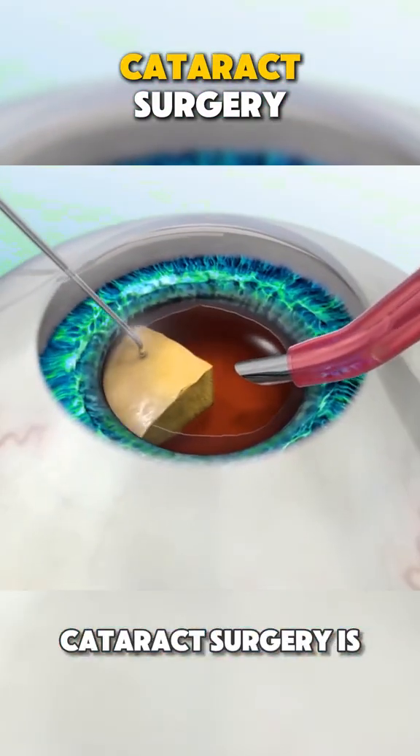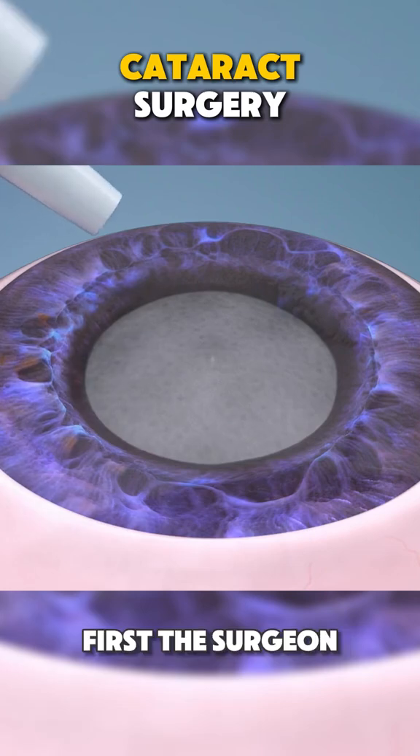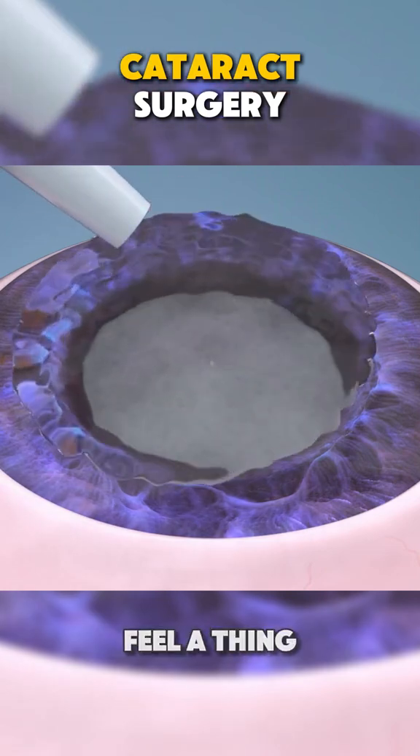Ever wondered how cataract surgery is performed? Let's break it down in just one minute. First, the surgeon numbs your eye with drops so you won't feel a thing.